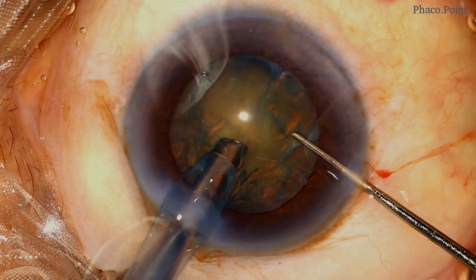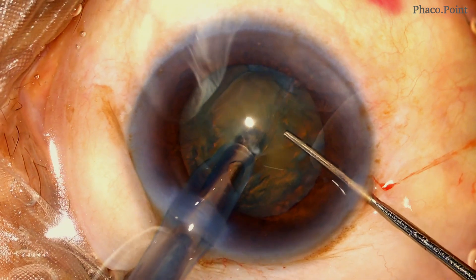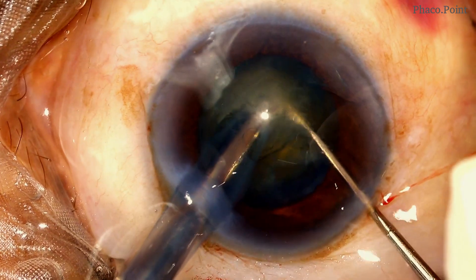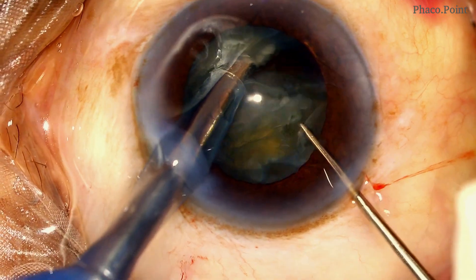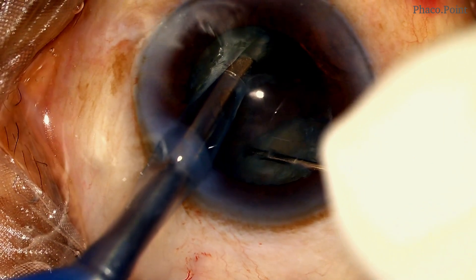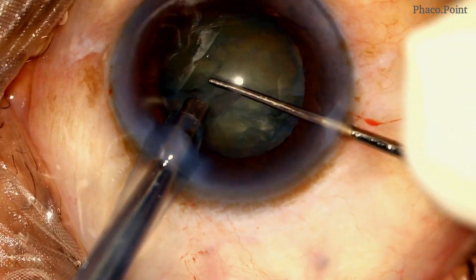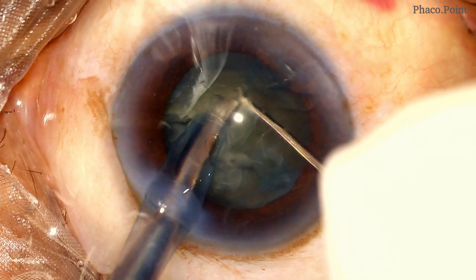The surgical technique chosen is that of a direct chop. The nucleus is impaled with the phaco probe and divided into two hemi-nuclei. Having divided the nucleus, it is now further subdivided into smaller emulsifiable fragments.